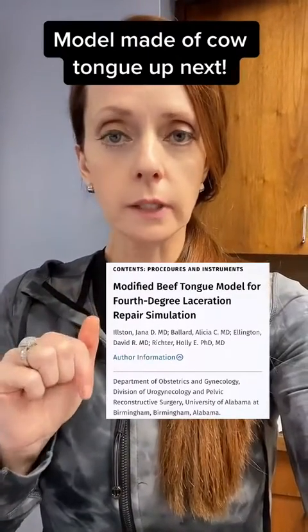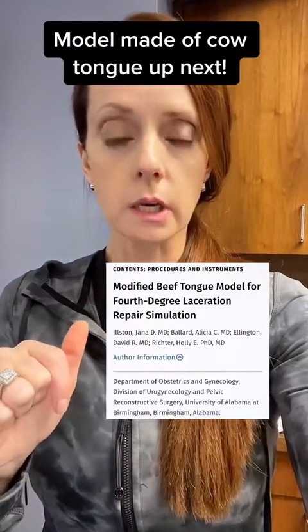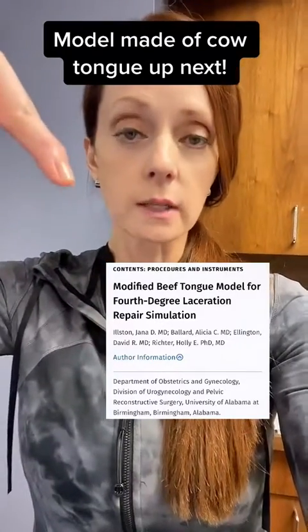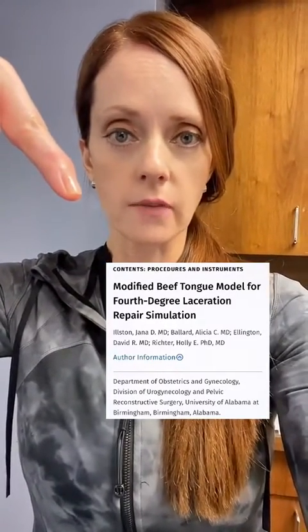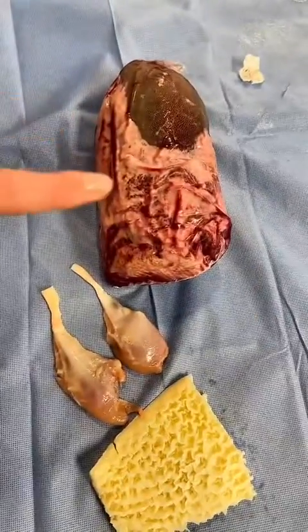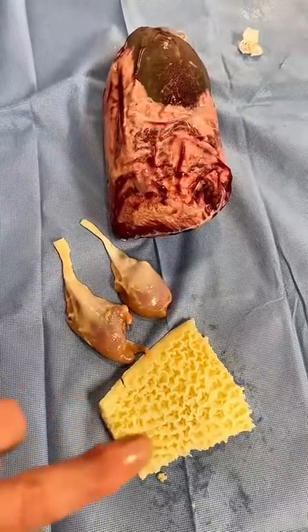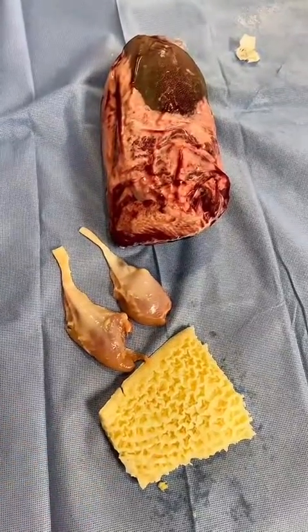Tomorrow the MFM fellows and faculty have put a simulation together to teach the residents how to repair third and fourth degree lacerations, using this model that was put out by the University of Alabama. One beef tongue, one package of chicken legs, and one package of tripe — which is beef intestine — will make 20 models.